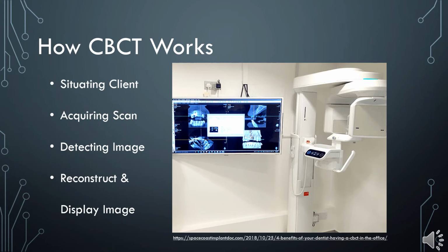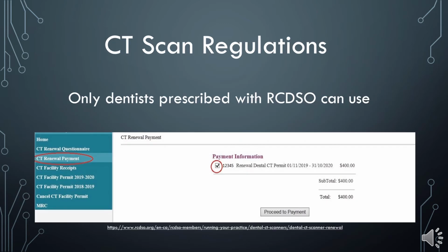Only dentists are able to prescribe, order, and take dental CT scans and must register with the Royal College of Dental Surgeons of Ontario. Dentists who want to install and operate a scanner in their facility must obtain a permit that is renewed annually.